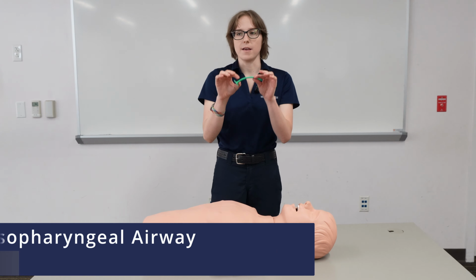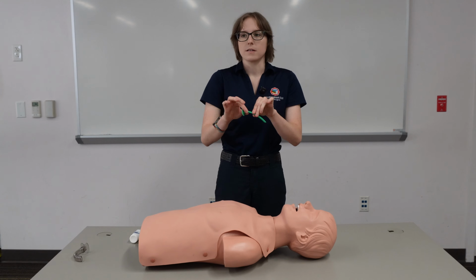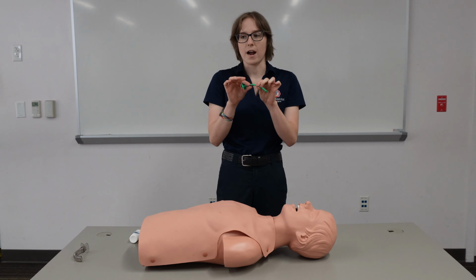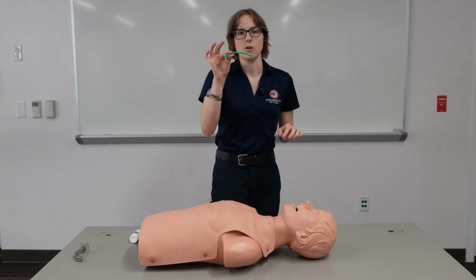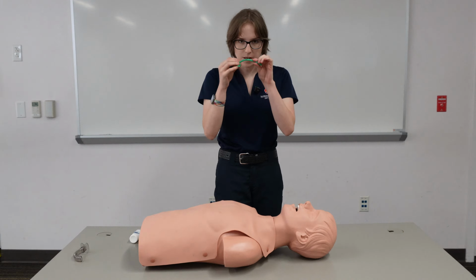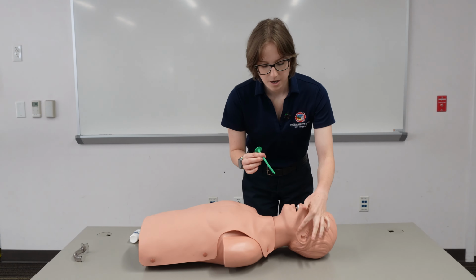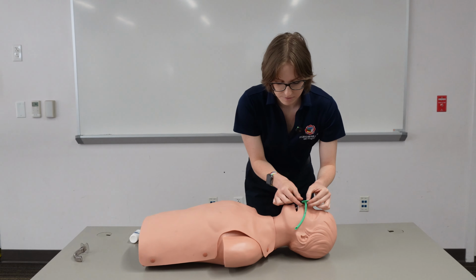Next would be the NPA. Indications for using an NPA is when an OPA cannot be inserted, so if your patient has a gag reflex. However, if your patient has a suspected fracture to the base of their skull or facial trauma, this is contraindicated and you cannot use this device. To measure the NPA, we're going to measure from the patient's tip of their nose to the earlobe, like so.